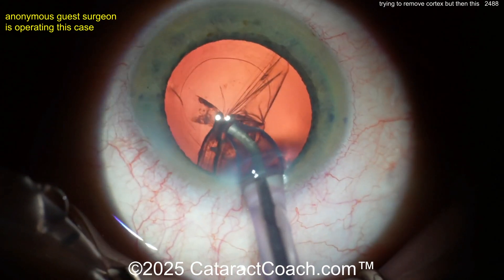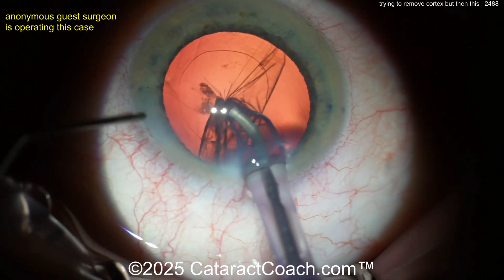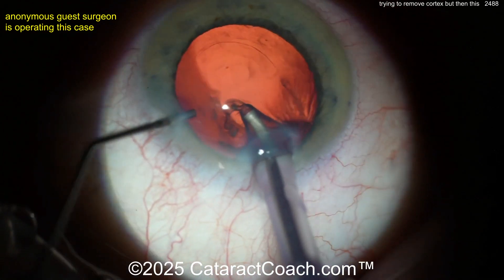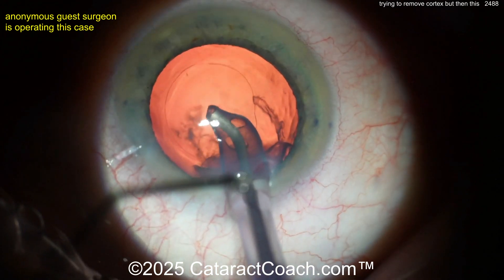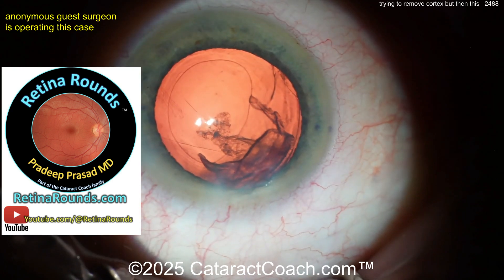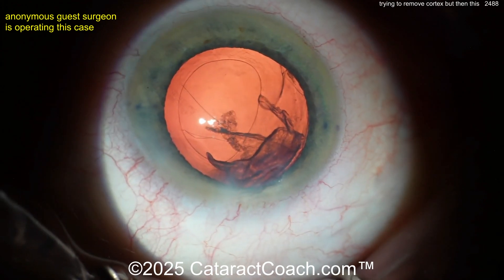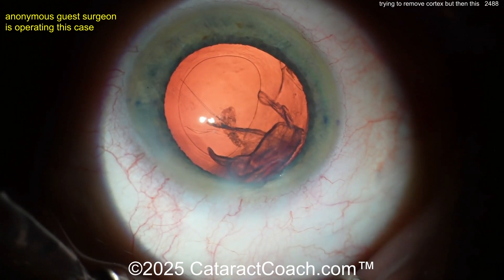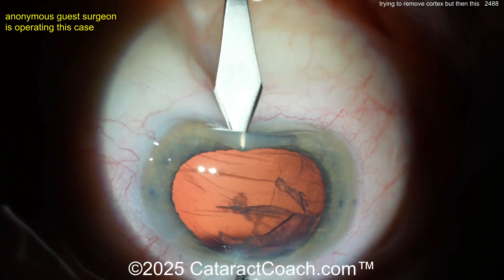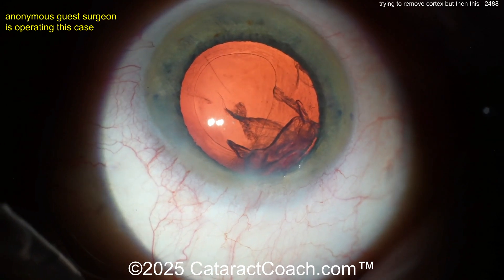Pulling this out is very tough. Now you have to think: what am I going to do for IOL placement? The class is going inside — okay, let's give a little bit of time to think about what we should do here. In a case like this, is it time to call in a retina specialist? Check out retinarounds.com, our new sister channel — as of March 1st, new video every single day, plus YouTube at Retina Rounds. Sign up for the free daily email, just like cataractcoach.com.